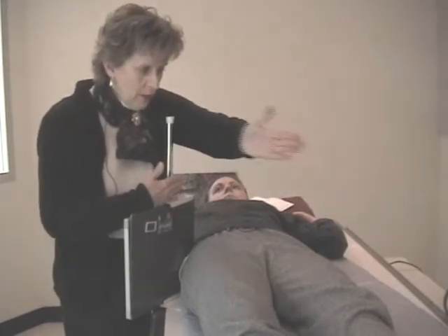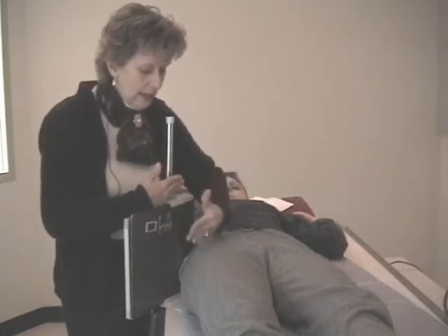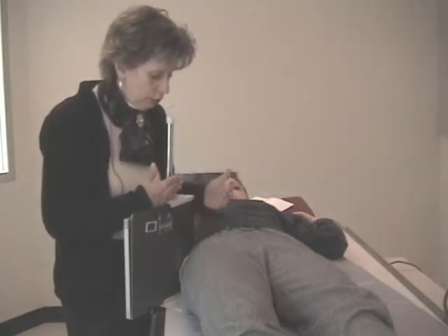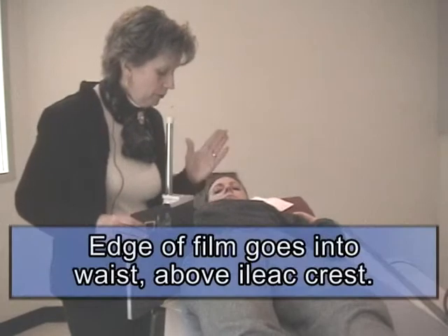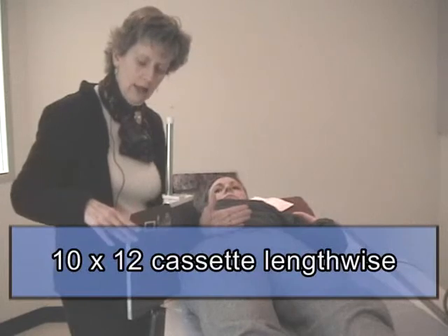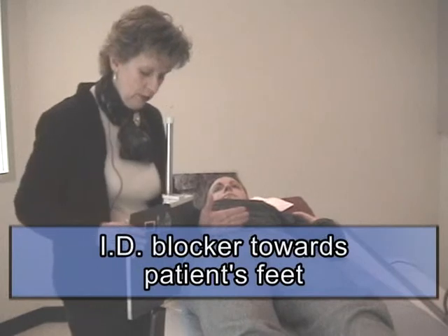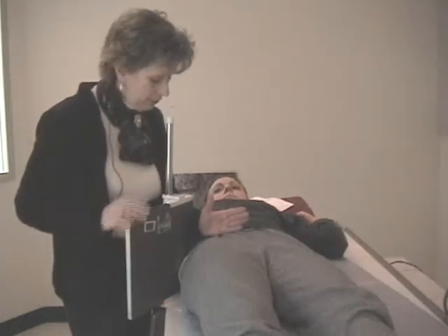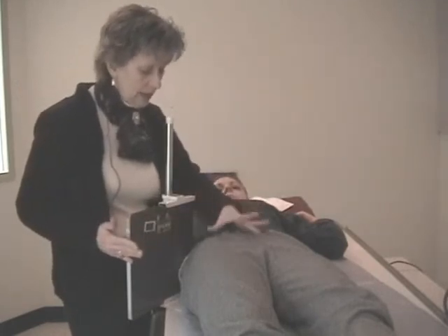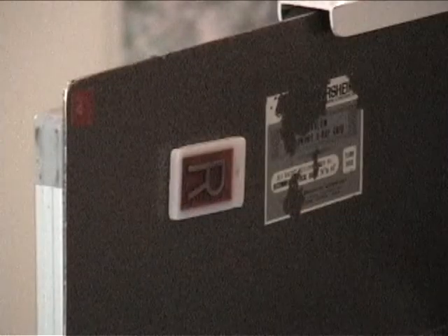We want the tube coming in perpendicular to the femoral neck to give it a true size and a true shape measurement without distortion. So again, film's edge into the patient's waist, 10 by 12 cassette lengthwise. ID blocker is caudal, towards the patient's feet, with a portable grid on there. The cassette is angled away from the body to where it's 90 degrees from that imaginary line. I've tentatively put a right marker on there.